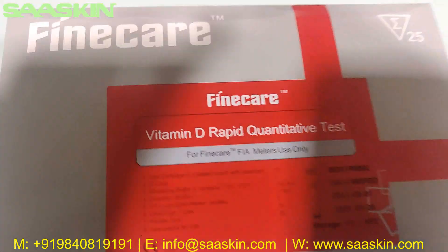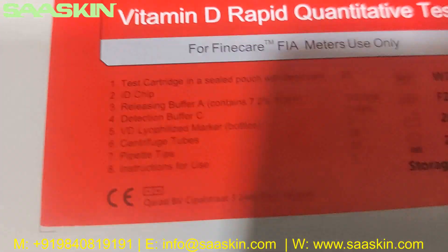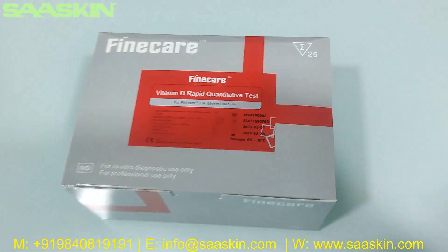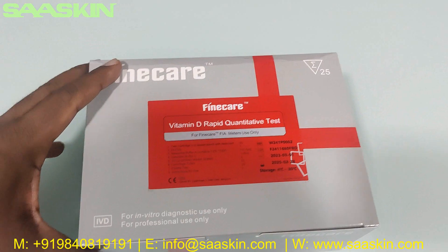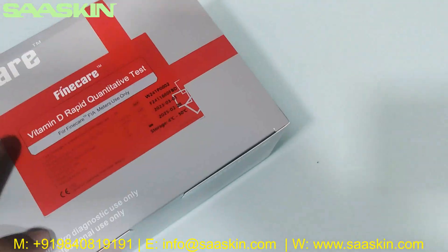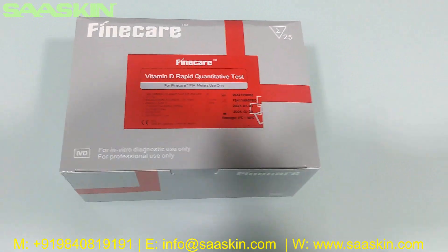This is how the box looks like — let me show you closely. This is how the total box looks like, and I will go around the box for you. Okay, here you go.